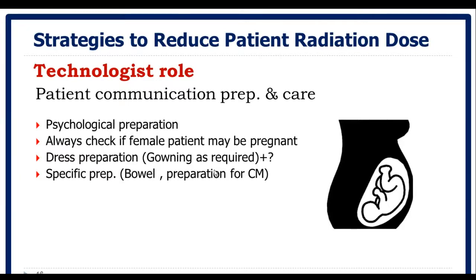So we need to be careful about this point, in addition to specific preparation that is required for contrast media procedures such as fasting and so on.